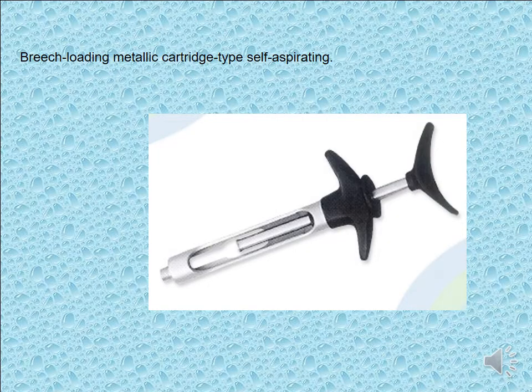Other type, breech-loading metallic cartridge type, self-aspirating. This is a complex syringe that can by itself aspirate a fluid, but it needs a high pressure, so it is expensive and not used very widely in the dental clinic.